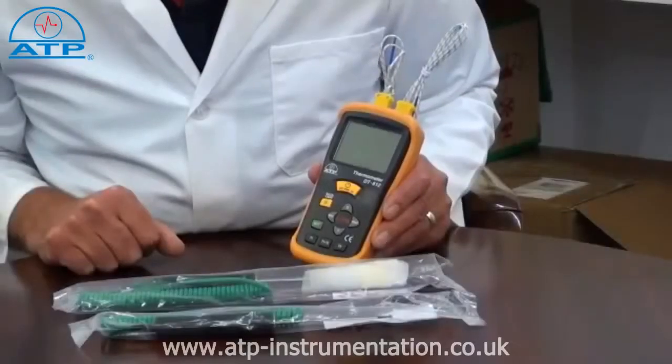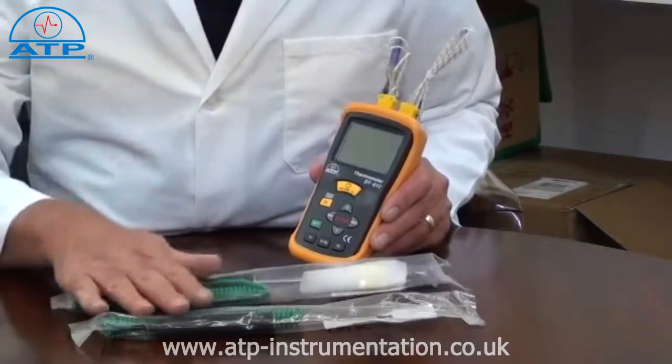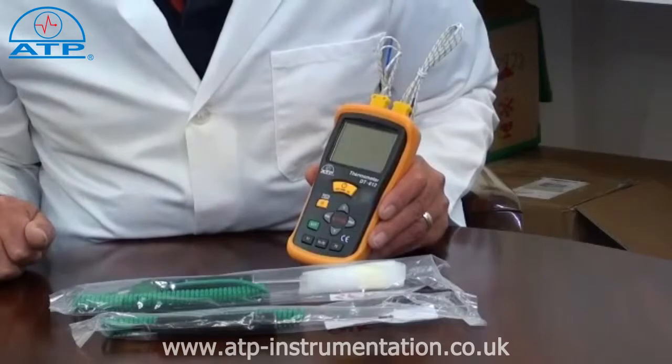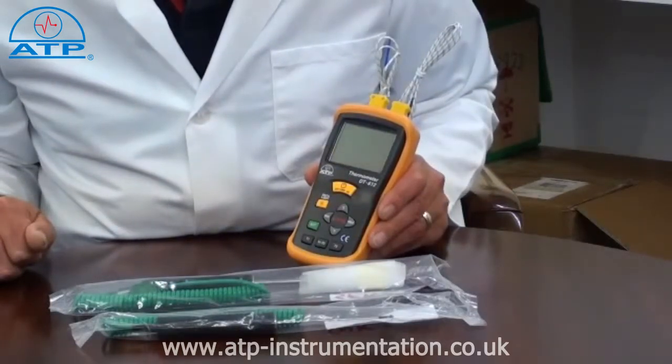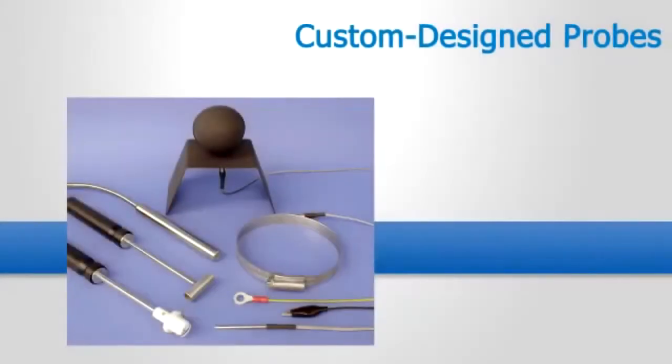The thermometer is ideal for many applications as we offer a range of interchangeable plug-in probes. These cover typical applications such as air, liquid, penetration, immersion and surface temperature measurements. If you have an application that requires a specially designed probe then we can manufacture to your specification.